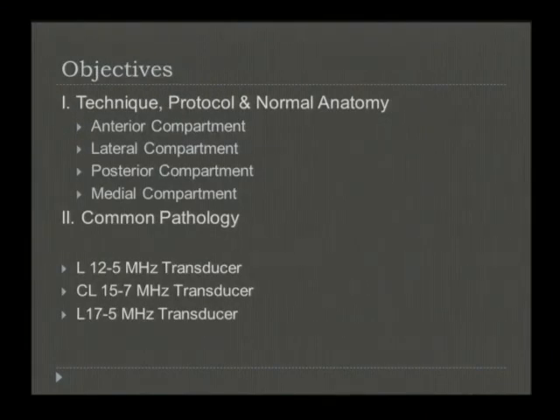So we're going to talk about ankle ultrasound. I'm just curious, how many people actually perform ankle ultrasound in their services? That's good, quite a number of people. As you all know, this is more of a focused exam. We typically have patients who have pain referred to a particular region, and so we like to compartmentalize this. We typically look at certain structures, but we compartmentalize it into an anterior, a lateral, a posterior, and a medial compartment. We'll go through all of the structures in a systematic way.